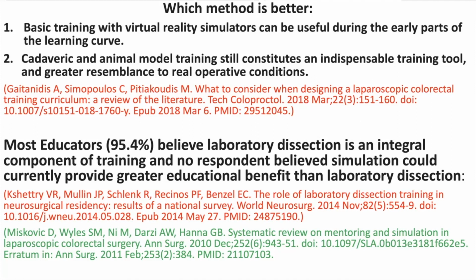For basic training, virtual reality simulators can be useful during the early part of your endoscopic learning. Cadaveric and animal model training still constitute an indispensable training tool. These have greater resemblance to the real operative conditions. Most educators believed laboratory training is an integral component of the training, and no respondent believed that simulation in its present form could provide greater educational benefit than laboratory dissection.